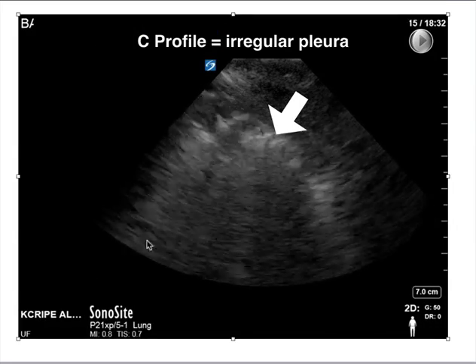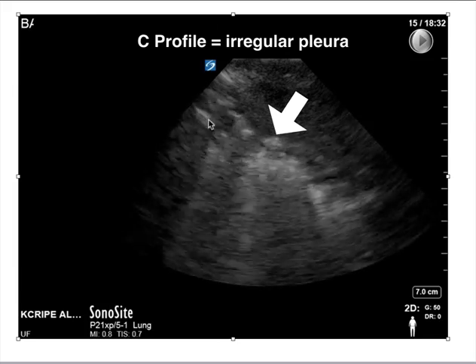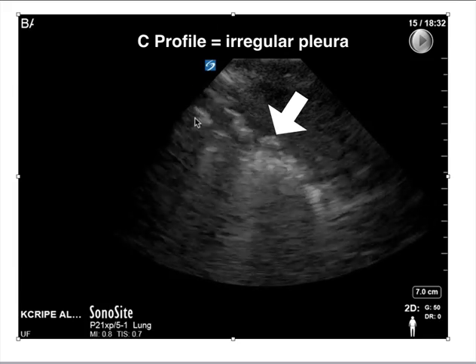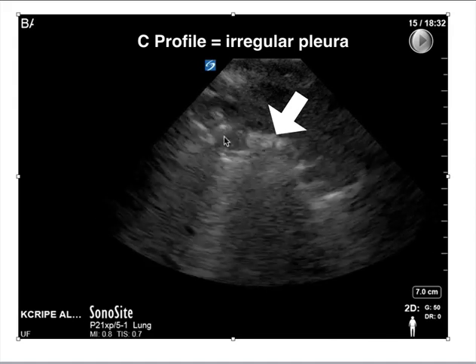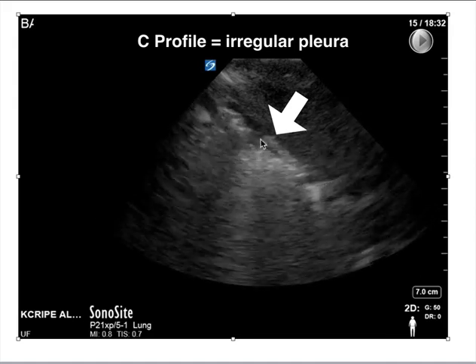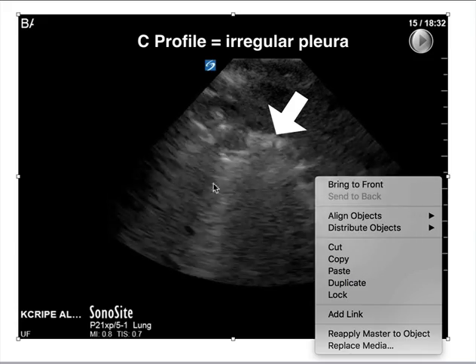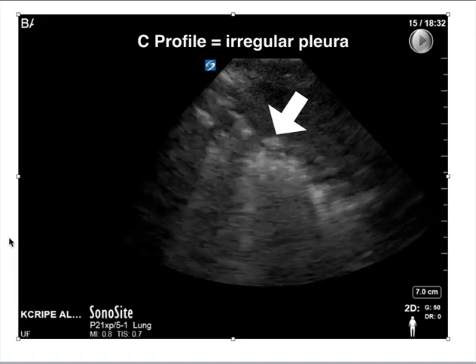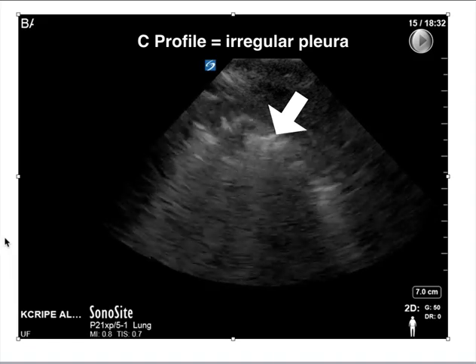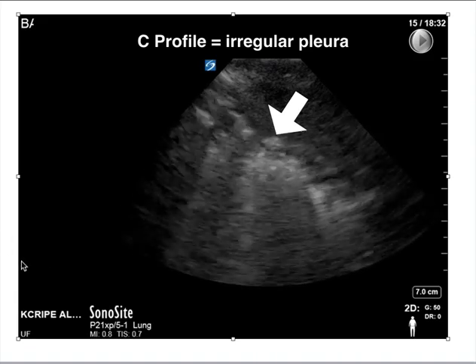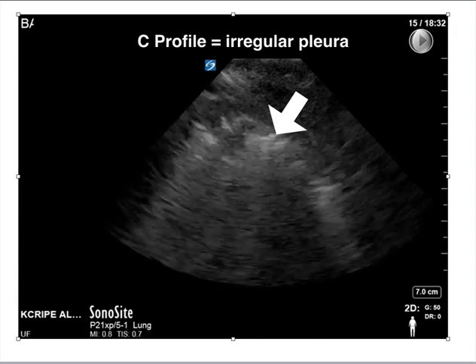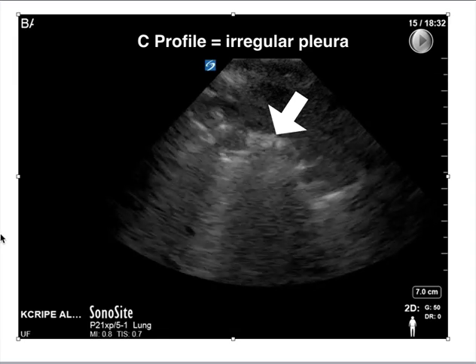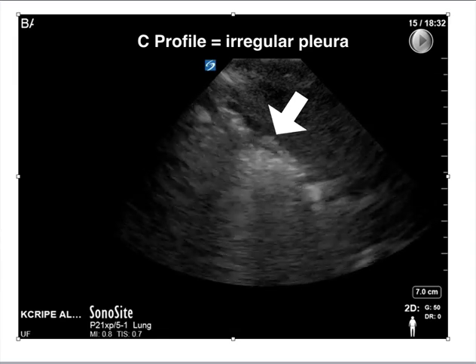Another thing that people fail to see is irregular borders. This is a zoom-in of the pleura. Remember from the basic lecture, the pleura is usually a nice white hyperechoic line. In this case, you can see it's an irregular border — this is called a C-profile. When you see a C-profile, that can indicate pneumonia in that particular area of the lung. I have also seen this with pulmonary contusions and pleural-based masses, so it doesn't always equal pneumonia, but it can lead you toward that diagnosis.